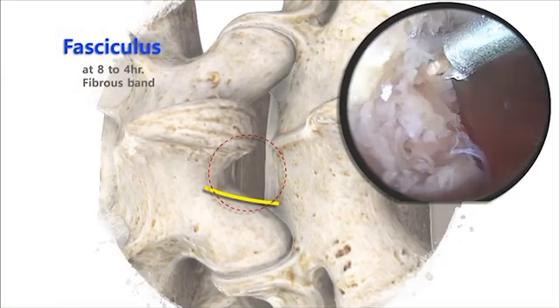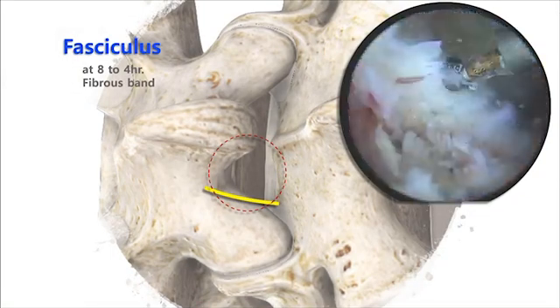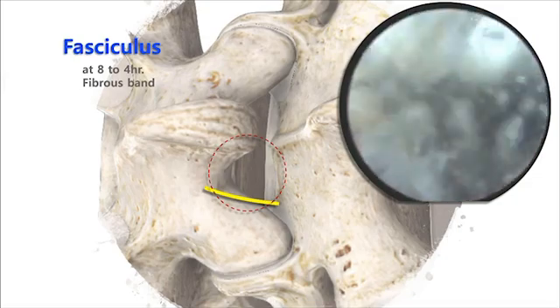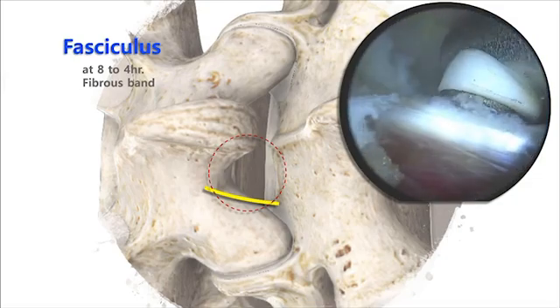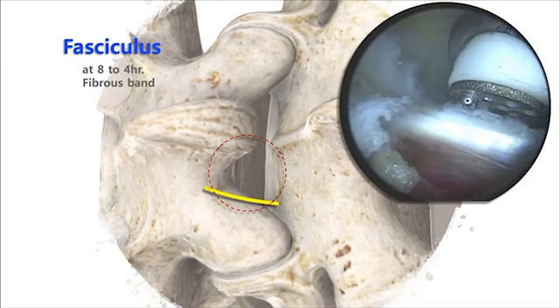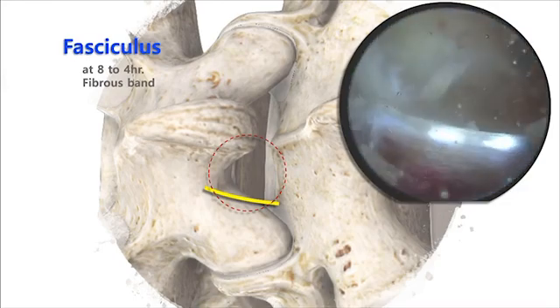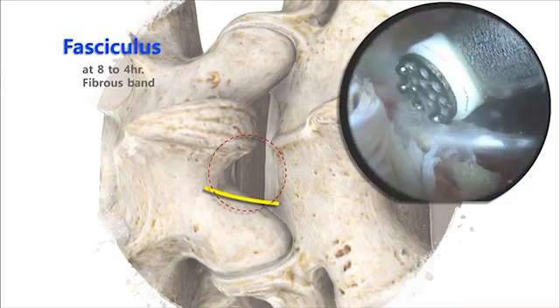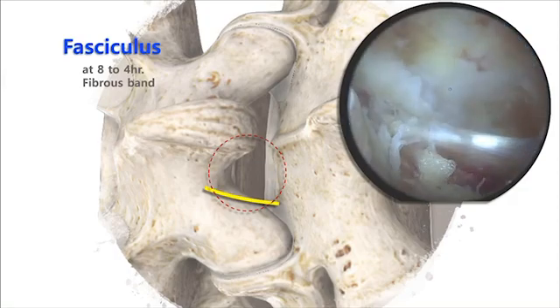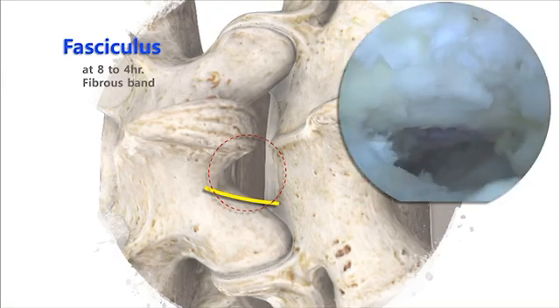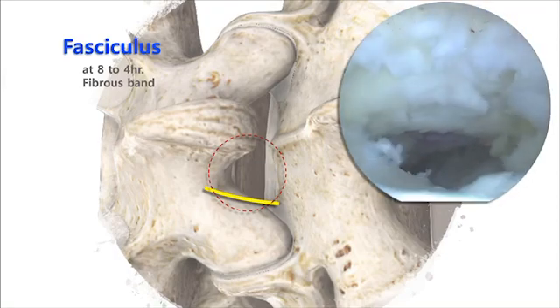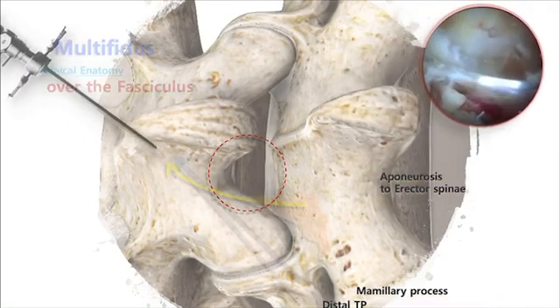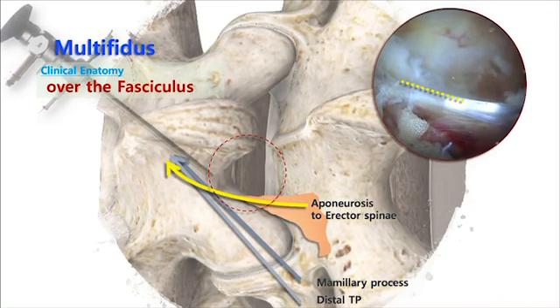During the ipsilateral posterior approach, you can see the fibrous band at the 8 to 4 o'clock direction, which lands on the dorsal surface of the lamina. It is located outside of the working space, so you do not need to eliminate the fibrous band for orientation — your target place is just inside of it.